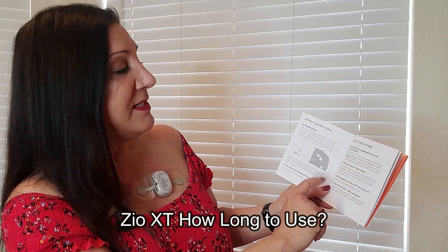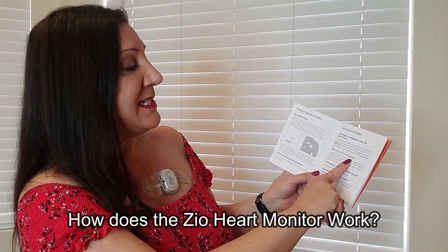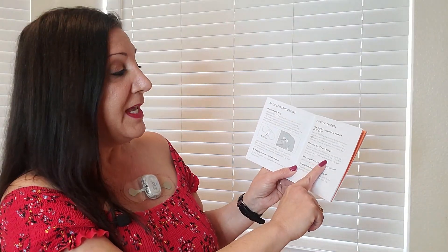How long are you supposed to wear the Zio XT patch? It depends on what your doctor says. How does the Zio XT patch work? It records every heartbeat. Your physician will use that data to look at your heart rhythm and determine a proper course of action.